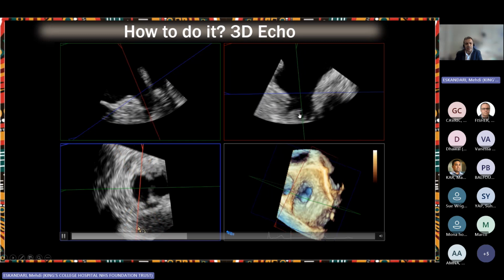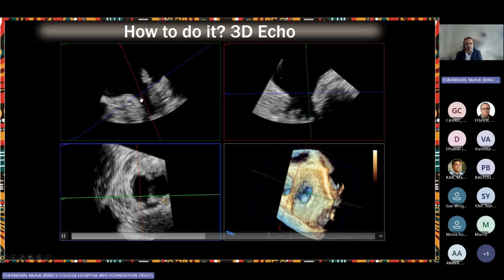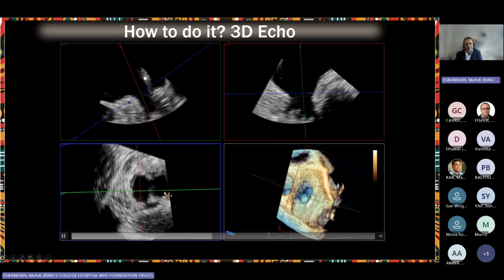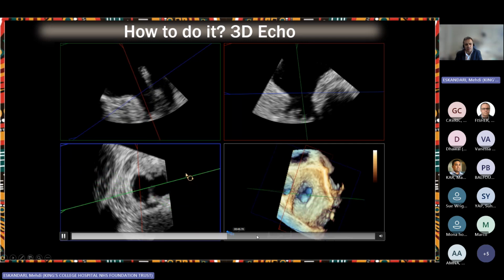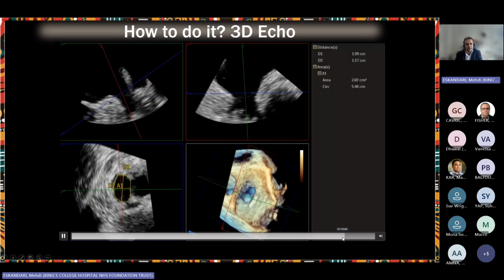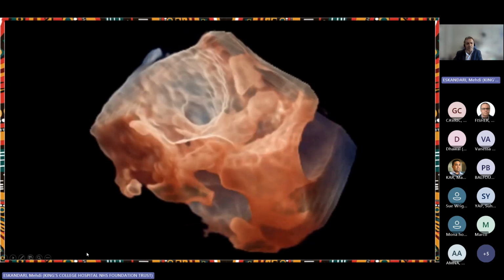And then, as already alluded to, there are measurements that have to be done at a certain distance from the top of the ridge, and the most accurate way of doing those measurements is by 3D, and this is how you do it. You can do the perimeter and area, but often the 2D measurements are taken for sizing, not the area or perimeters themselves.